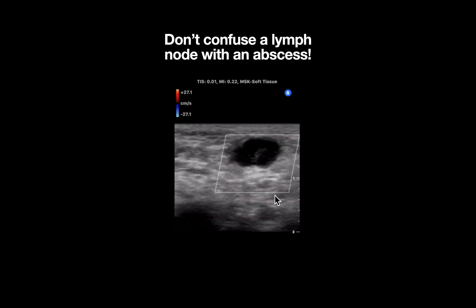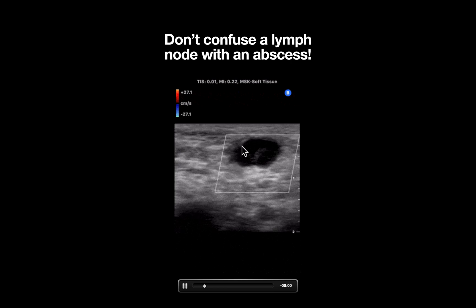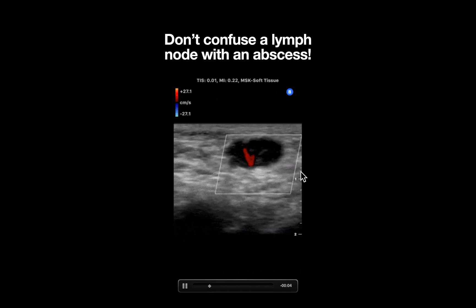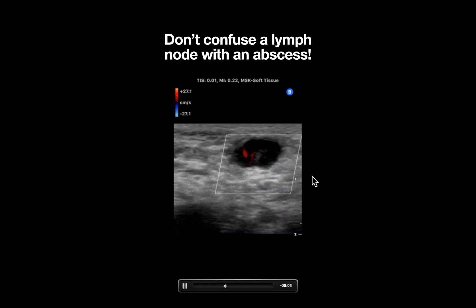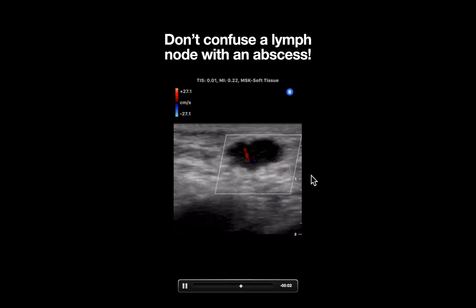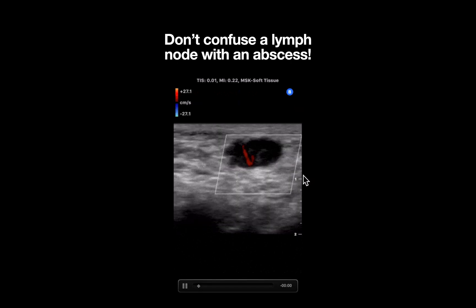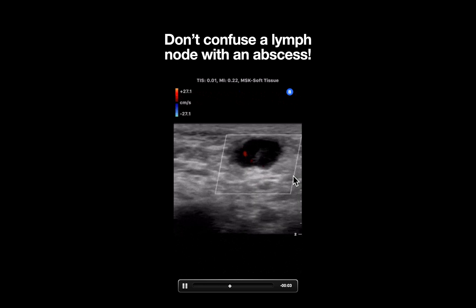Notice that when there is no color Doppler on, this anechoic structure could definitely be mistaken for an abscess. So always remember to apply color Doppler to all apparent fluid collections to ensure that what you are seeing is not a lymph node or a blood vessel.